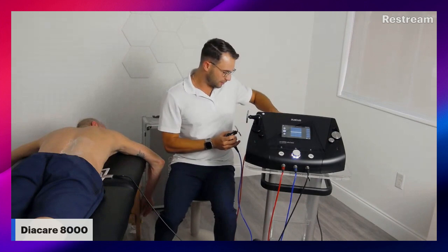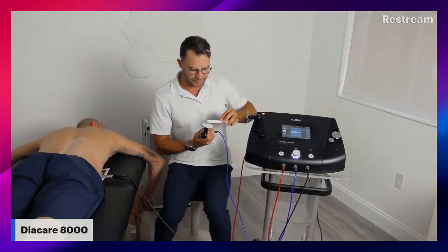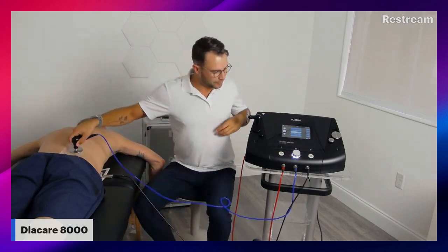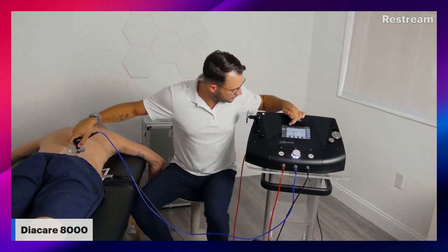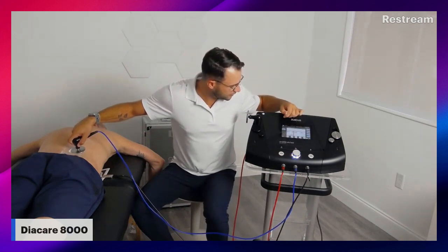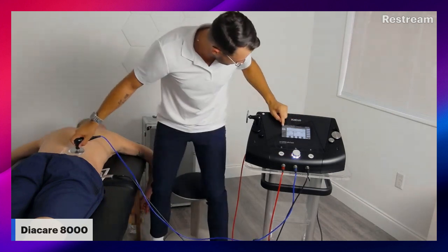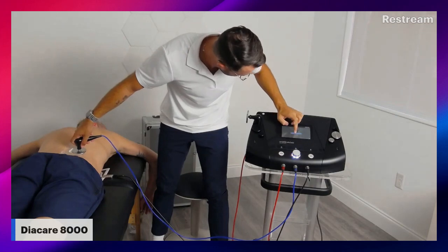We're going to come back over here. We're going to add a little bit more of that conductive lubricant. We're going to place it on our patient. Go ahead, hit OK here. And once again, we're going to calibrate the machine.